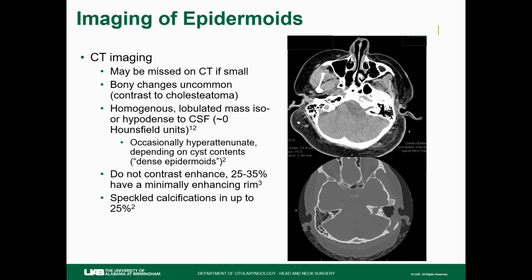They typically do not contrast enhance, though a proportion may have a minimally enhancing rim, and calcifications are occasionally seen. These are two of my patients.